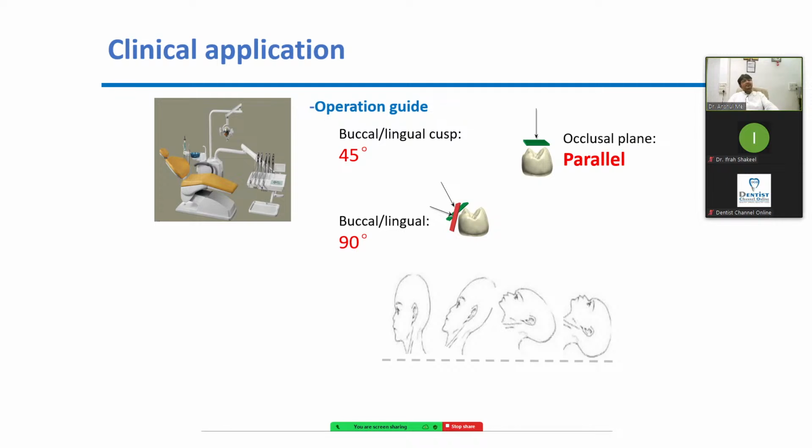The same way, the angulation of your patient matters. When you have a lower, you keep the patient upright and scan it. When you have an upper, you should make the patient supine and go to the back side of the patient and scan from there. For the upper, the operator is on the back side, and for the lower, the operator is in front.